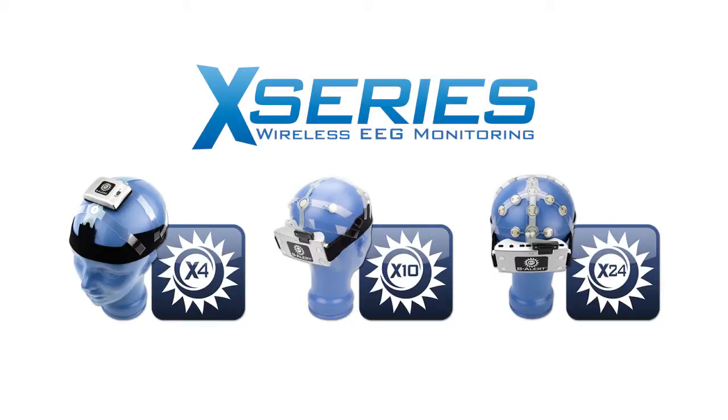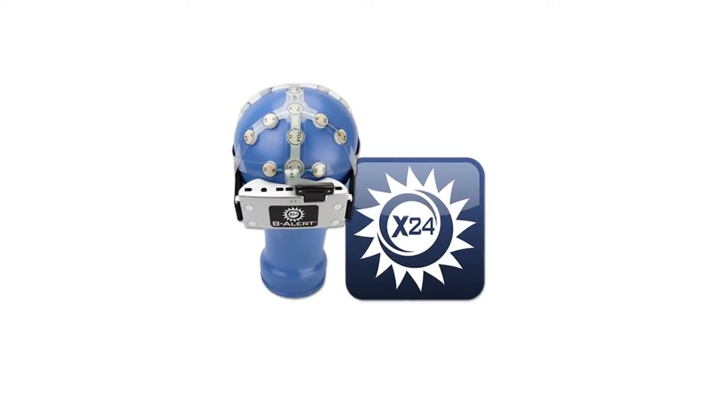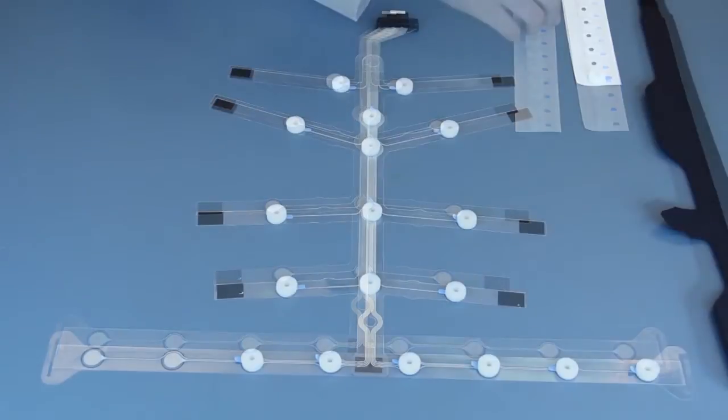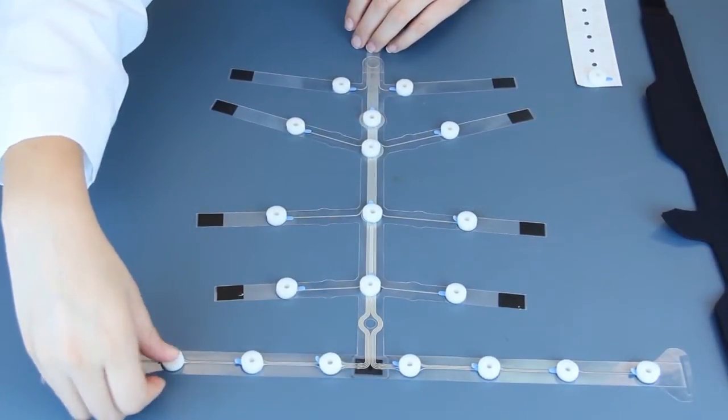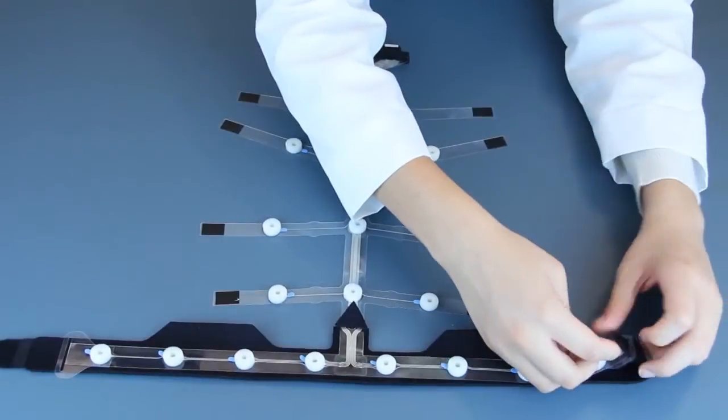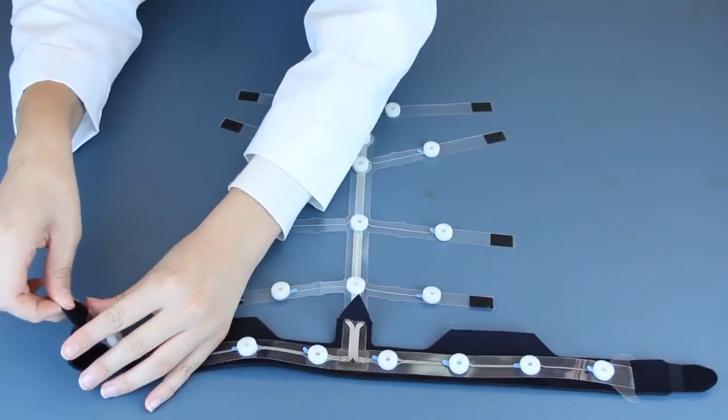All of the X-Series wireless EEG headsets share a unique design that combines quick, easy setups with comfortable, hours-long use. All soft conductive foam sensors are affixed to sites on pre-configured sensor strips. The components combine to provide a comfortable fit with consistent electrode placements every time.